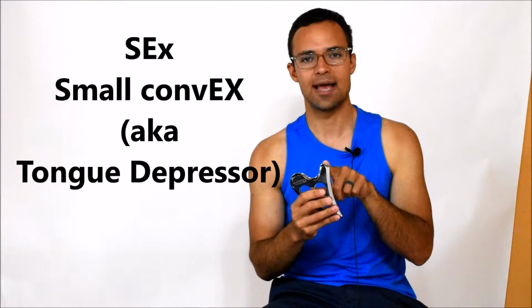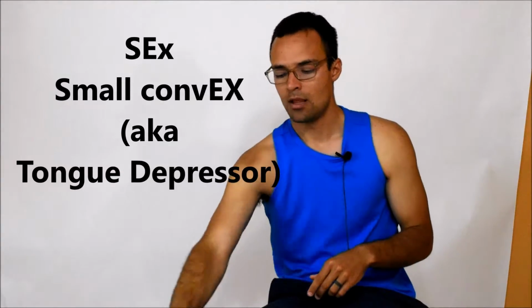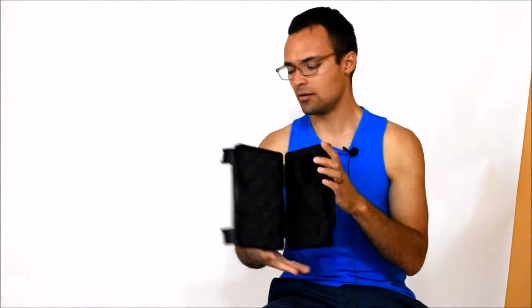or small convex. In the original, it's this one right here. In the lips, it's right here. And in the ergo, right here. Some people refer to this edge as the tongue depressor. So before we start, remember to apply emollient. Our emollient is made specifically for IAFM. It's solid at room temperature and melts upon contact, and it's made with natural ingredients. It's also made to fit our handy dandy case here. Nice little space for it right here.